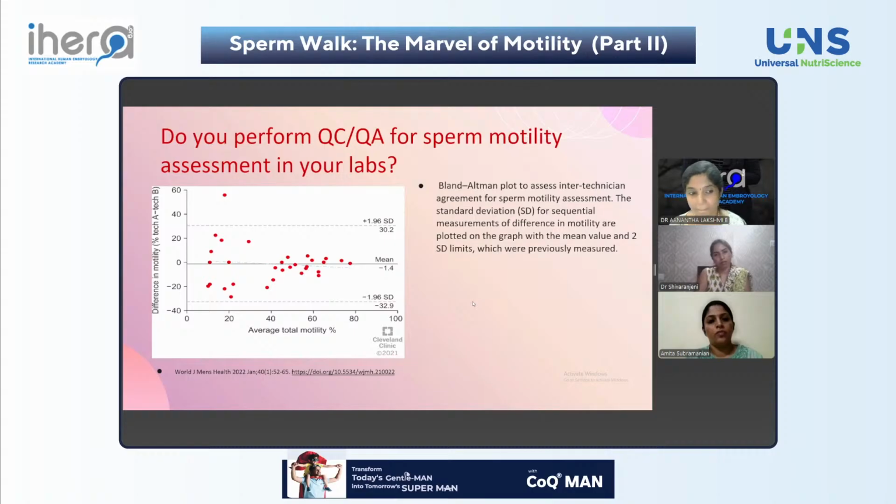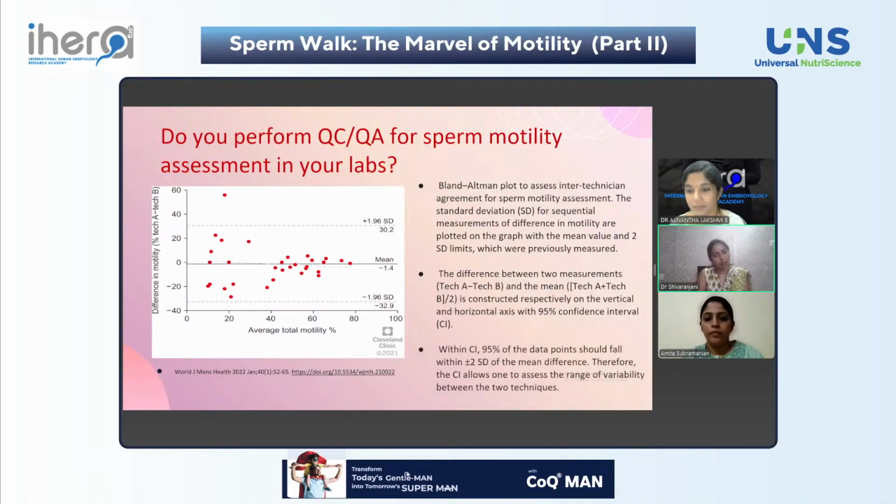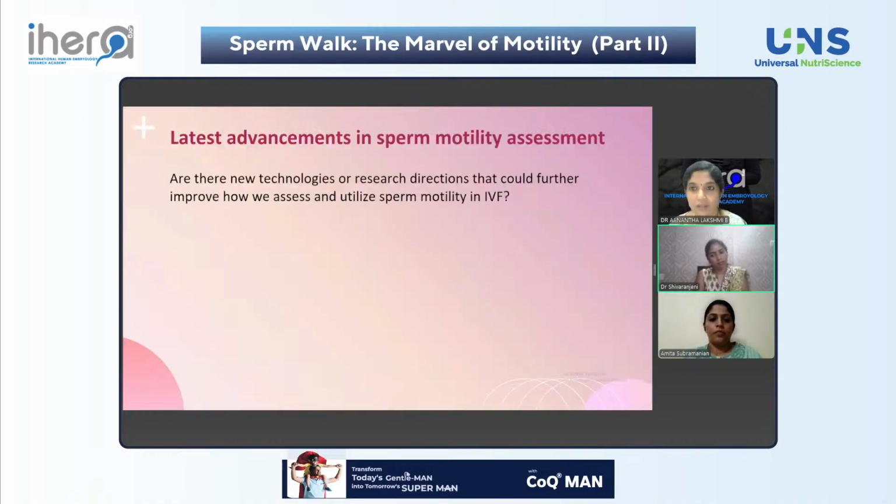If more deviation is there, then a third person has to check the sample, and then we'll see accordingly whether motility is proper or not. Thank you for that, sir. So, moving on.